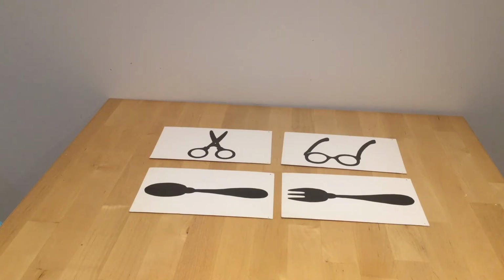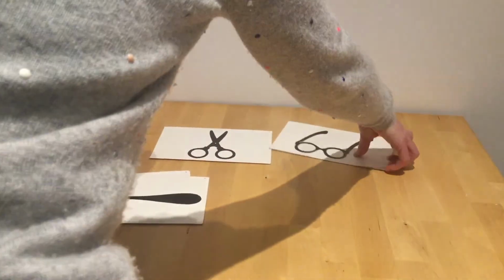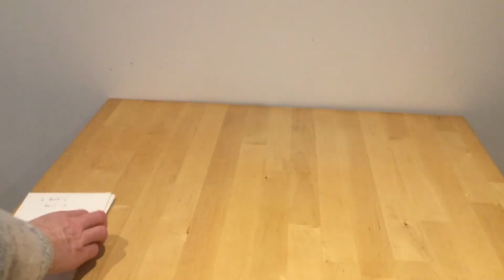You would start off by presenting each card in set 1 individually. If they are all correct, you can either move on and do all of set 2, or you can miss set 2 and move on to set 3.